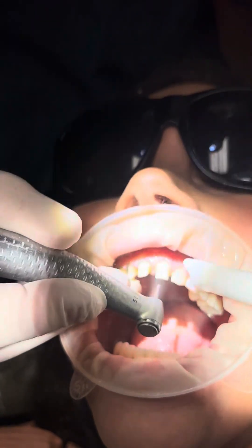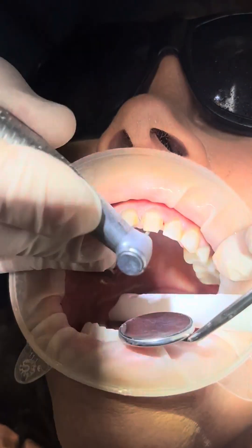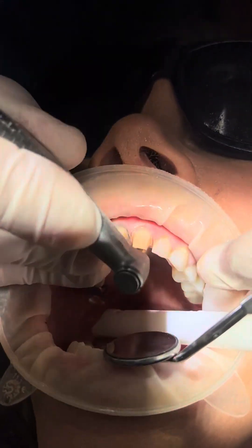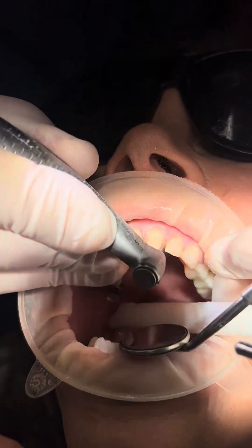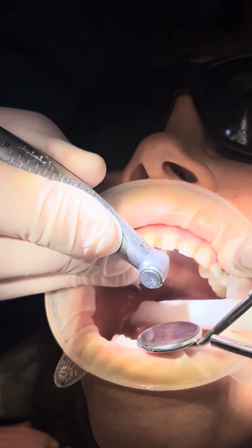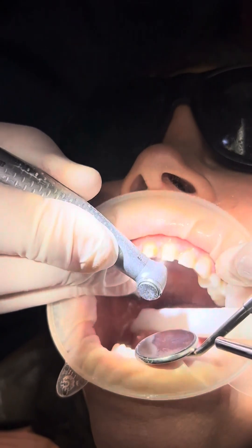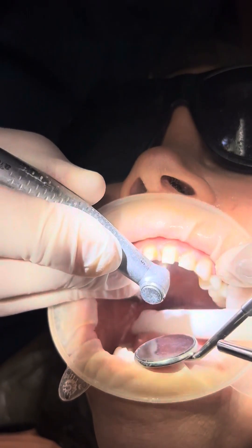Now I'm going to go to the lingual. I'm going to move into that indirect vision — I'm going to look in my mirror — and I'm going to start at the line angle here and at the gingival margin. I'm connecting it and it's coming around, so that's the rocker of the gingival margin here.